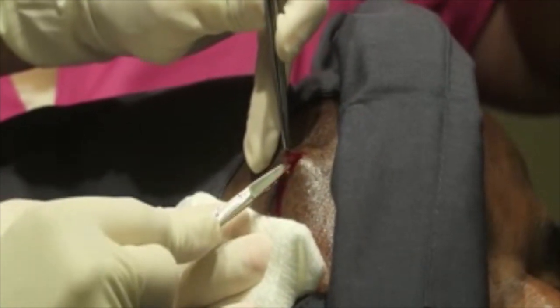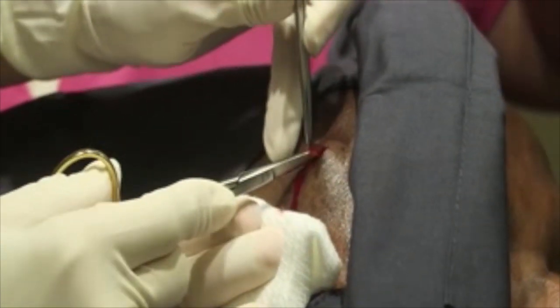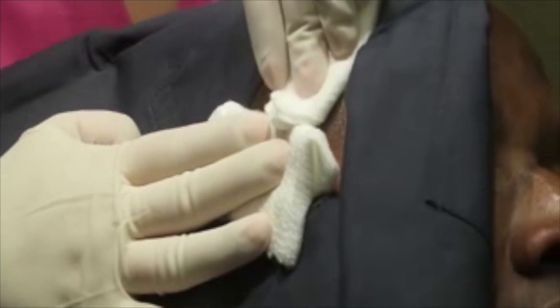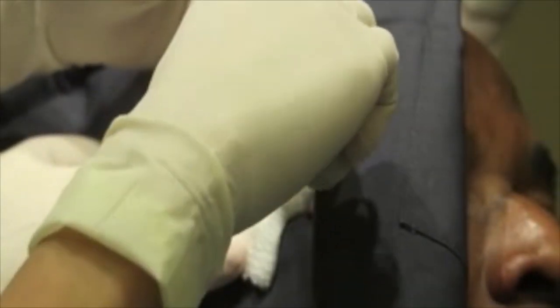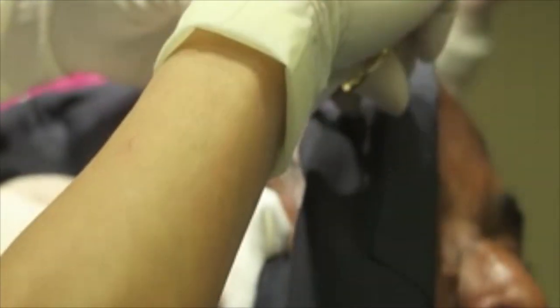Yeah, I do think this is a little lipoma. We shall see for sure. But as I mentioned to him before, it's not uncommon for scalp to ooze a little bit more. We have a lot of little finer blood vessels here, but it's nothing to worry about, and you're not bleeding excessively or anything. We certainly don't need any kind of transfusion or anything like that.